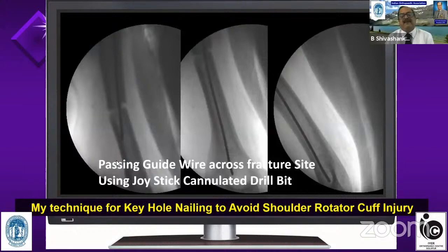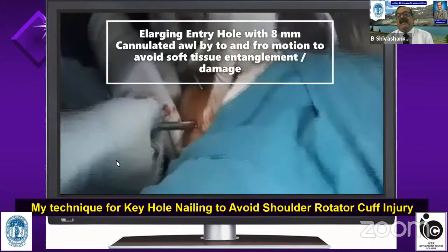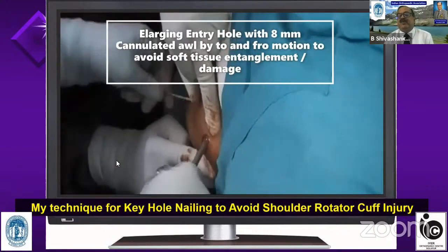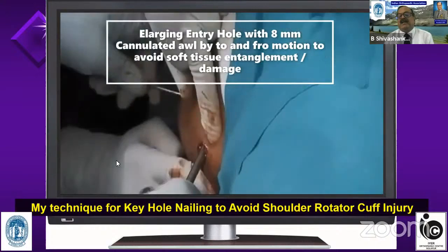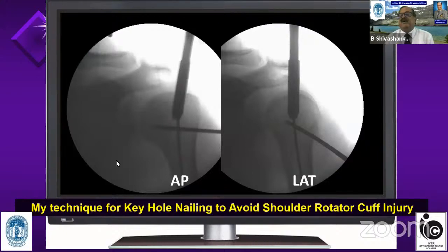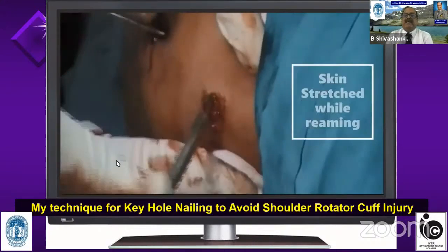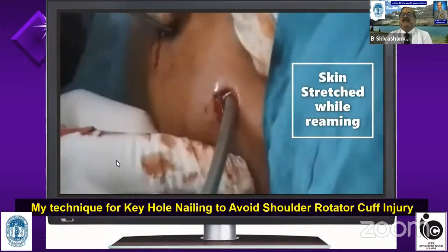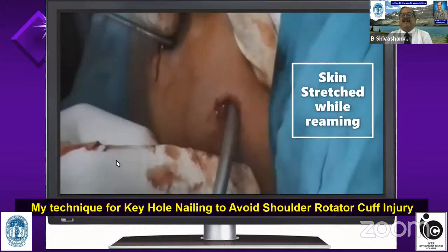Now once the guide wire has gone across to the distal fragment, I enlarge the entry with an 8 mm cannulated awl, which comes with the set. Again, you can see it's a to and fro motion. If you rotate it with a power drill, all the soft tissue will get entangled and damaged. So by to and fro motion, I am going to make an entry, and once that is done, I always ream. There is no role of unreamed nailing.